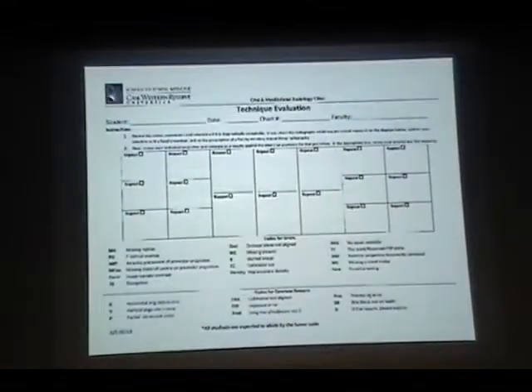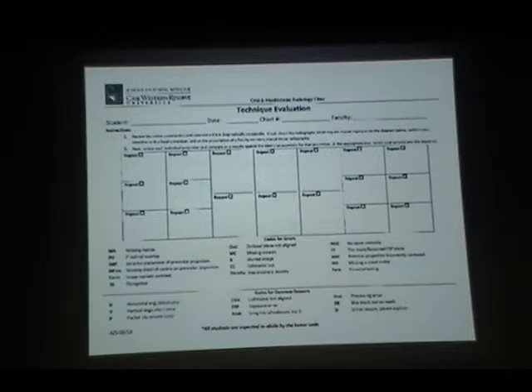So now, what are the forms that we use in the clinic? This is the form that you're supposed to use when you submit your competency. Before you submit a competency, there is something called experience. You can do n number of experiences, doesn't matter to us. For competency, at least one experience, and then you do your competency. Full mouth series: you should be able to demonstrate that you can take a good set of full mouth series using the criteria that we discussed.